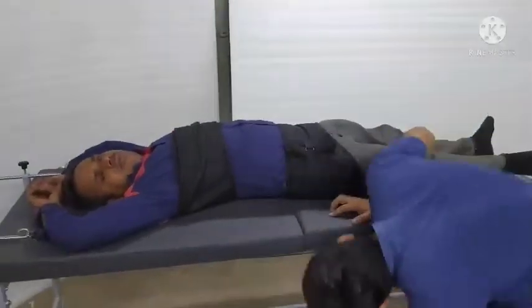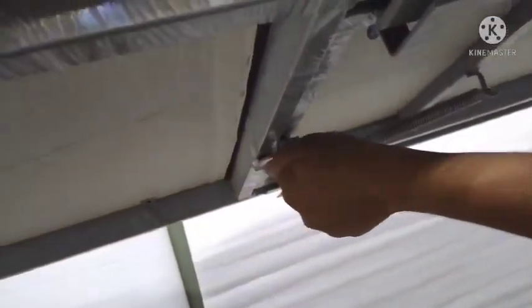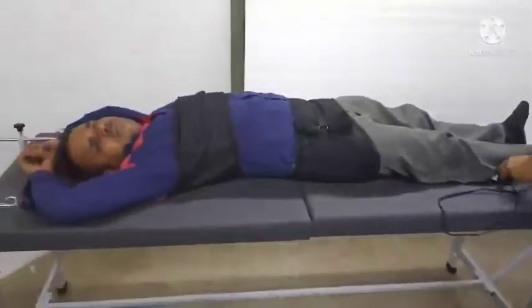Now, before we start, we have to unlock the table lock like this, so the table can move. Okay.